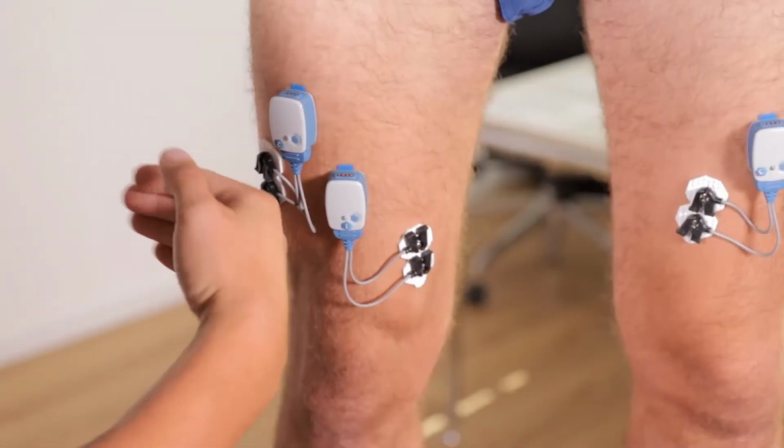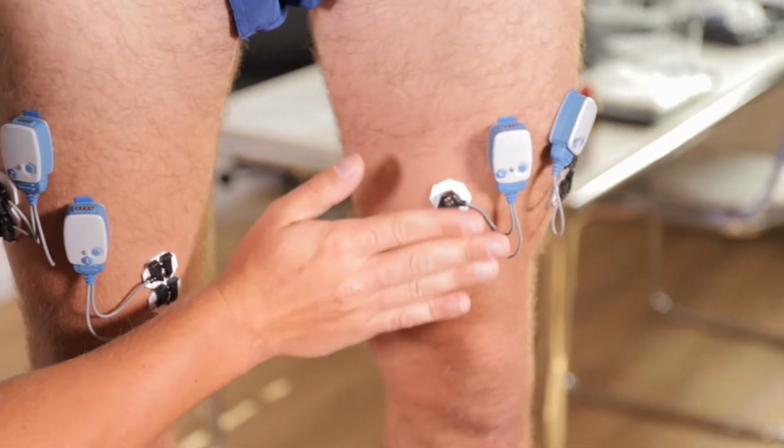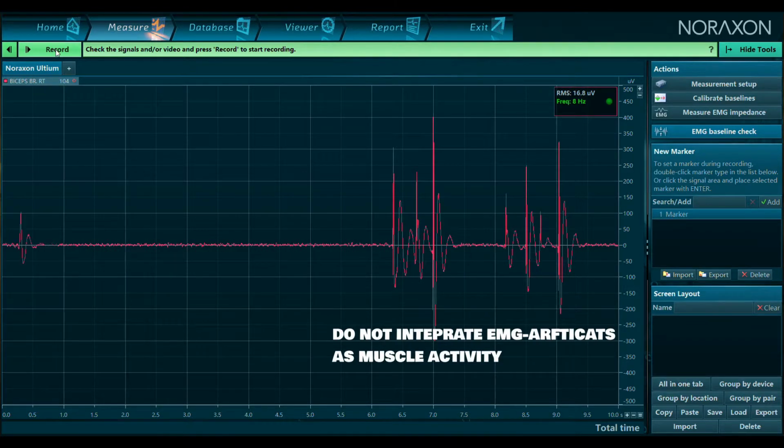Check how sensitive your derivation is against external influences, for example bumps, and make sure not to falsely interpret such disturbances in your measures.